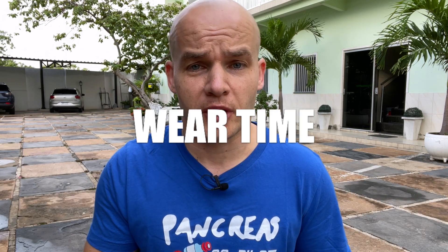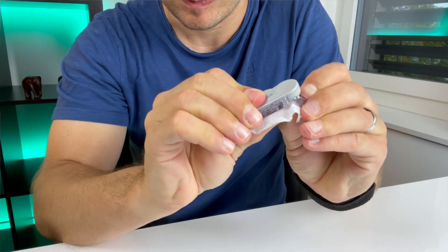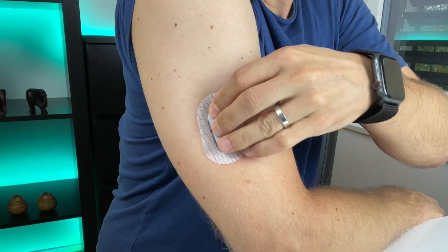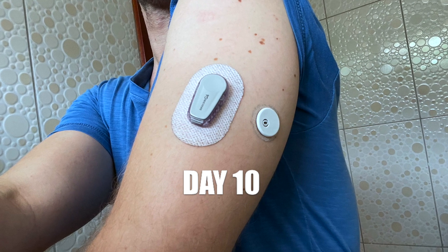Next difference is wear time — how long can you use these sensors. The official wear time of the Dexcom G6 sensor is 10 days, so after 10 days you need to change the sensor. The official lifetime of the Dexcom G6 transmitter is three months, so you don't throw out the gray piece and use it repeatedly with multiple sensors. The official wear time of Freestyle Libre 3 is 14 days, so with Freestyle Libre 3 you do a site change every two weeks. I had no issues with using these sensors for the whole period of their official lifetime. The only difference I found is that the Libre adhesive sticks a little bit better to my skin compared to Dexcom G6.